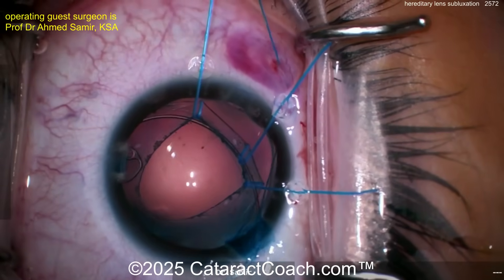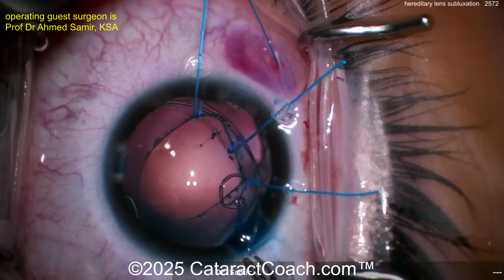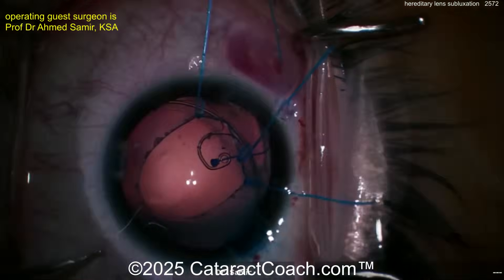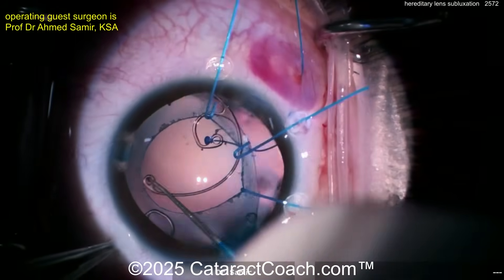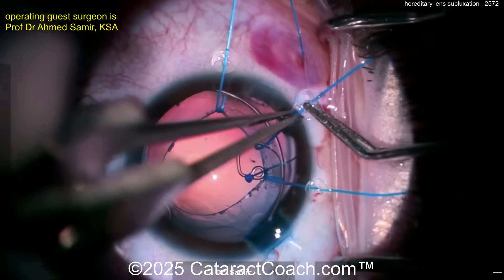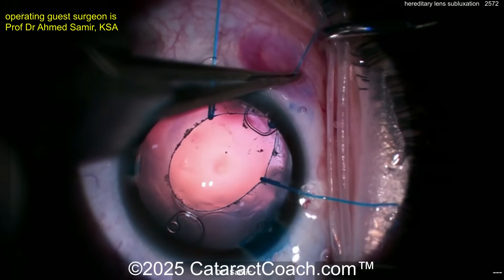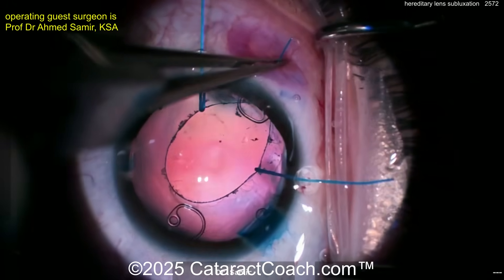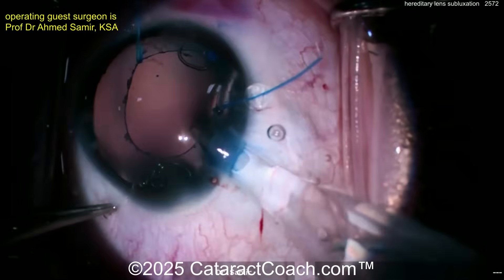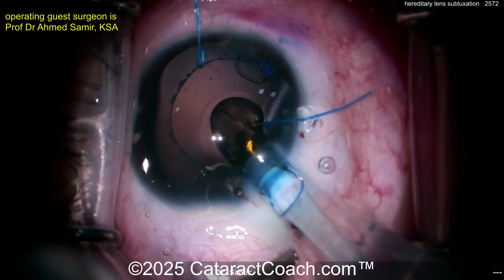The hard part is going to be lining this thing up. Once you get this in the capsular bag, make sure that eyelet is close to where the center of the zonular loss is. The J-shape of that eyelet — you want that J above the rhexis, not under it. The eyelet itself should be a little bit above the rhexis. I'd pull that eyelet up a little bit — I prefer it above the rhexis, not caught right at the edge. But again, this will work also.